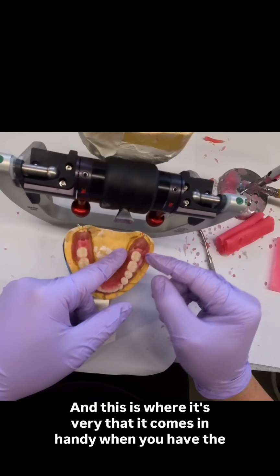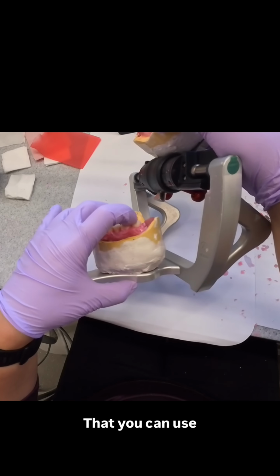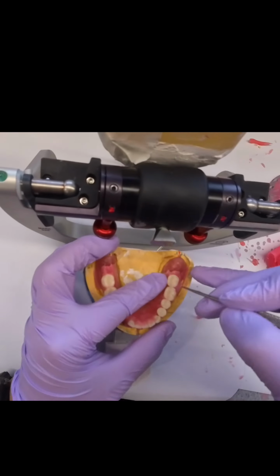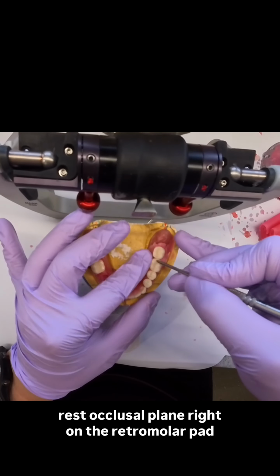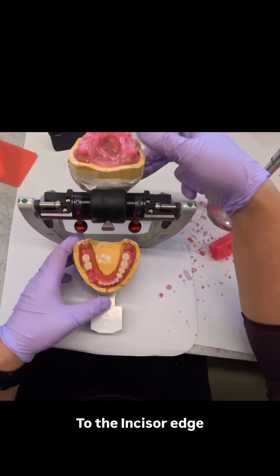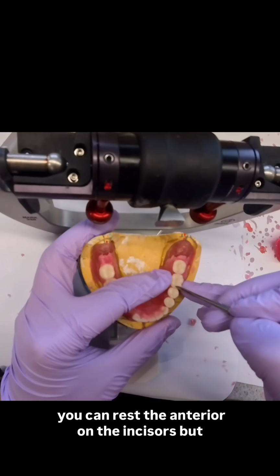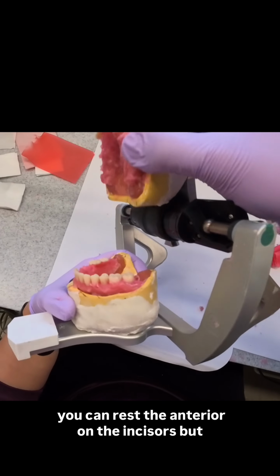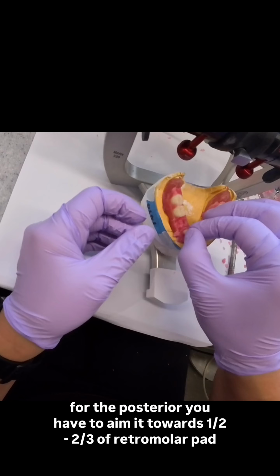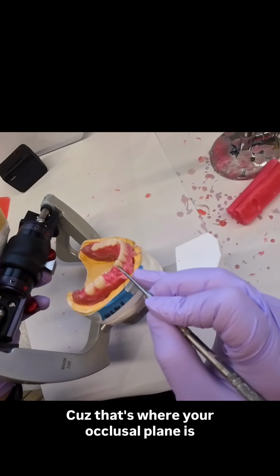And this is where it comes in handy when you have the occlusal plate that you can use. But make sure if you're using the occlusal plate, a lot of people would rest the occlusal plate right on the retromolar pad to the incisor edge. Make sure you aim your anterior, you can rest it on the incisors, but for the posterior, you have to aim it towards half to 2/3 retromolar pad, because that's where your occlusal plane is.